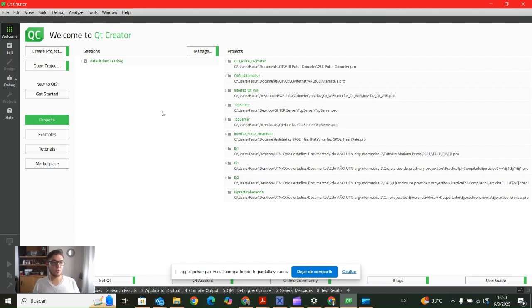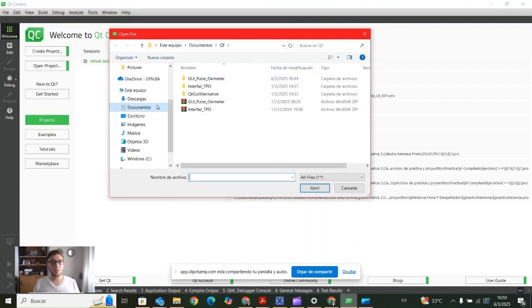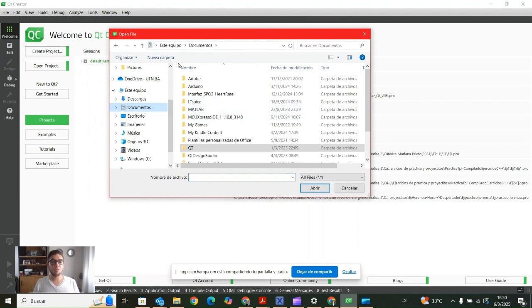Okay, to start with, we are going to open Qt Creator. I already have it opened. We go to File, Open File or Project. Typically, by default, Qt tries to save all the projects and documents in the Documents folder, typically named Qt. If it is not like that, I suggest you create a Qt folder and save the projects there.